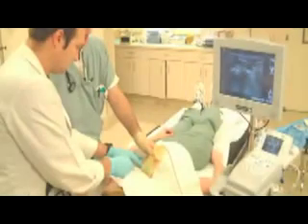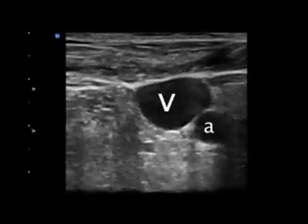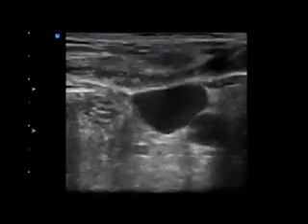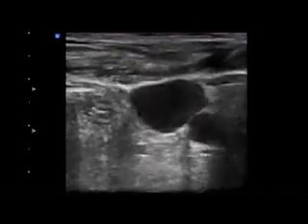Hold the probe with the marker dot to the patient's left side, so that the patient's left side is on the left side of the monitor and the patient's right side is on the right side of the monitor. The carotid artery will usually be the more medial structure and the internal jugular vein will be more lateral. However, there is significant variability in the position of the internal jugular vein in relation to the carotid artery, and it may be found overlying or even medial to the artery.